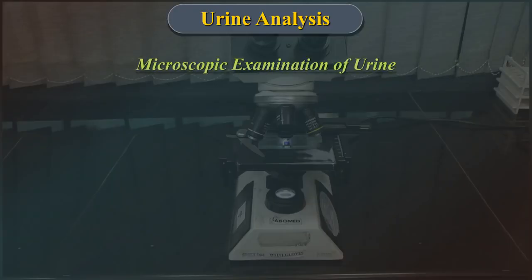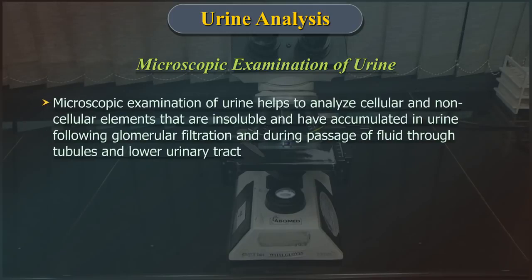Microscopic examination of urine. Microscopic examination of urine helps to analyze the cellular and non-cellular elements that are insoluble and have accumulated in the urine following glomerular filtration and during the passage of fluid through the tubules and the lower urinary tract.